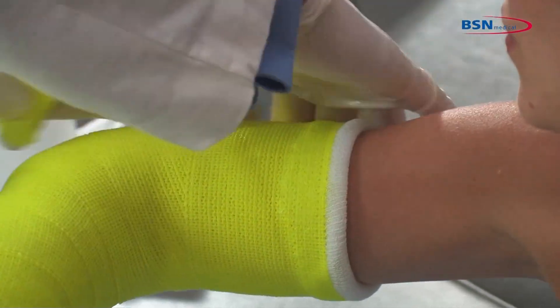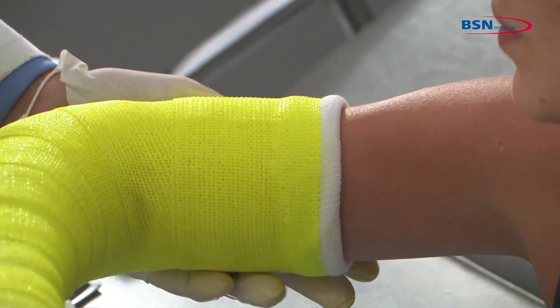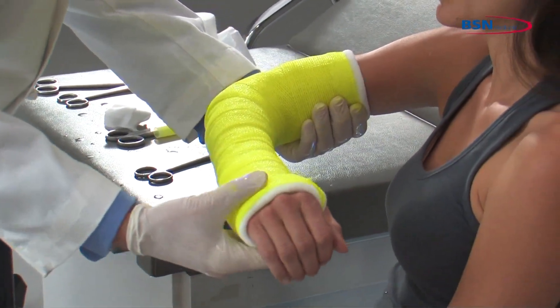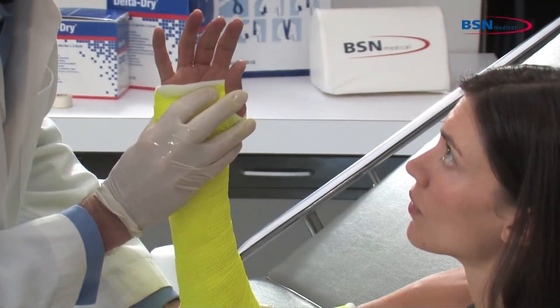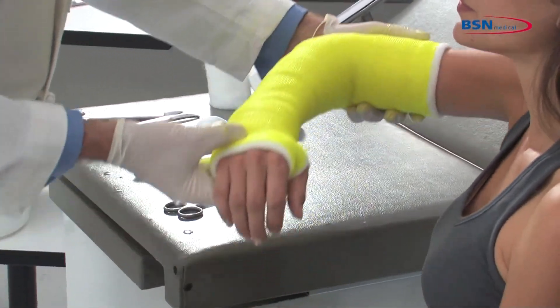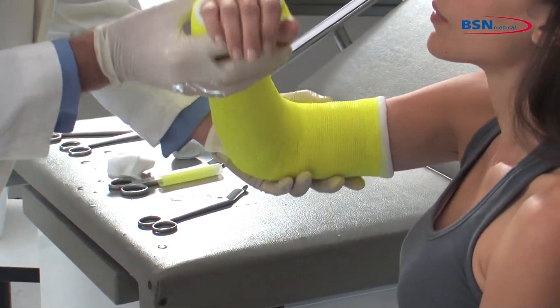Be sure to leave approximately 1½ inches of stockinette exposed to leave a soft end. Mold the cast with the palms of your hand. Check for any limitations in range of motion. Check for any pressure points that may cause irritation. And you are finished.